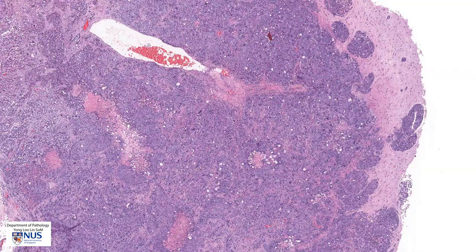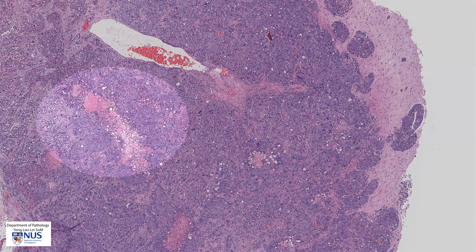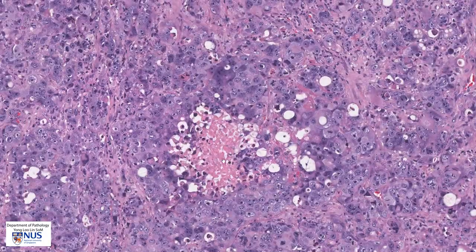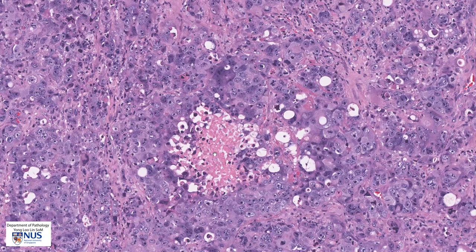Another feature that we can identify at lower magnification are these islands of pinkish areas here, and perhaps another area here. Taking a closer look, this actually represents foci of necrotic tumour cells with very dense eosinophilic cytoplasm and loss of nuclei. We have a few cells here with apoptotic nuclei that are just shrinking away.